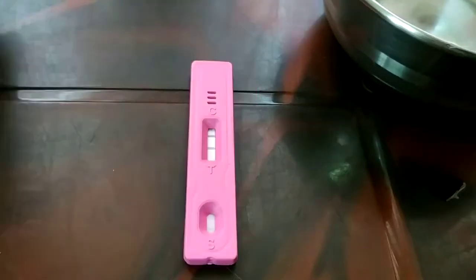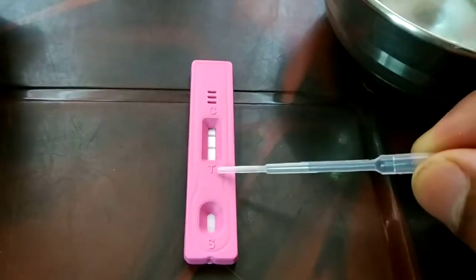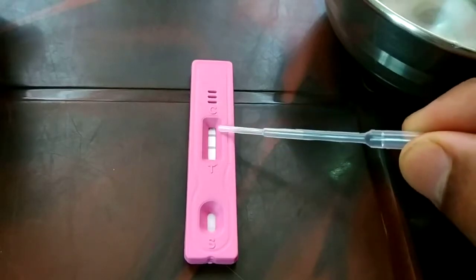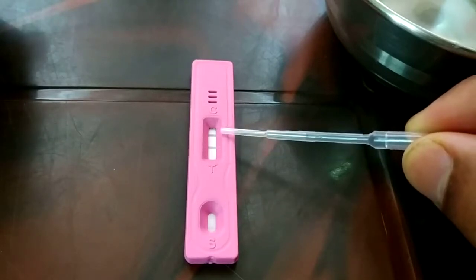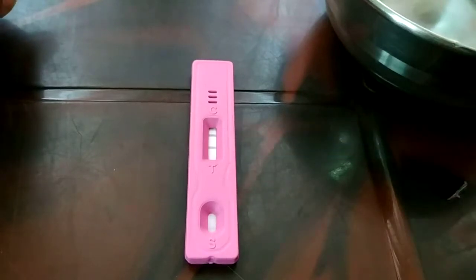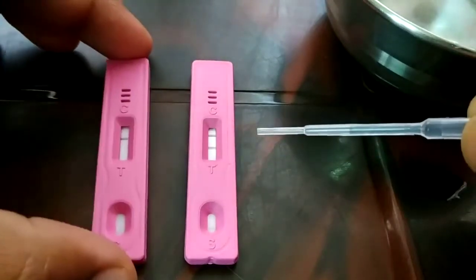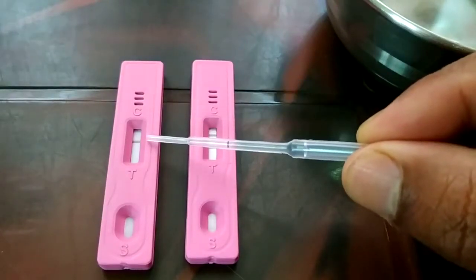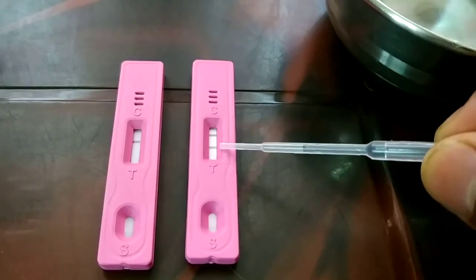If you get a result like this, you can see two dark lines: just above T you'll see a dark line, and just below C you'll see a dark line. If you have two different dark lines like this, that means you are definitely pregnant. So this gives you the positive or negative result — two lines is positive, one line below C only is negative.